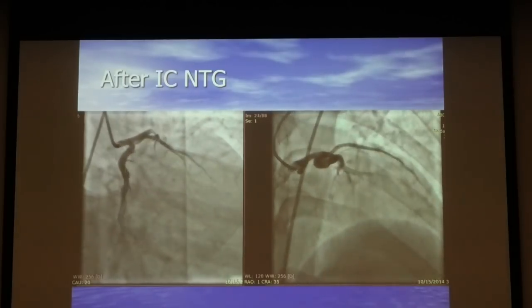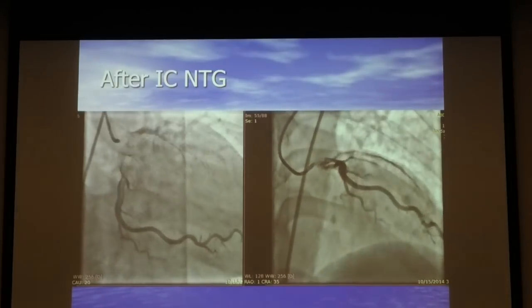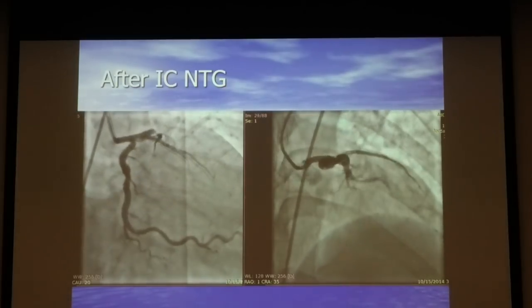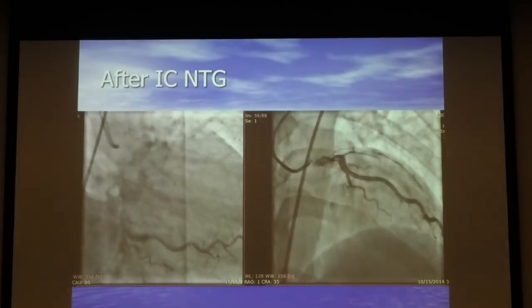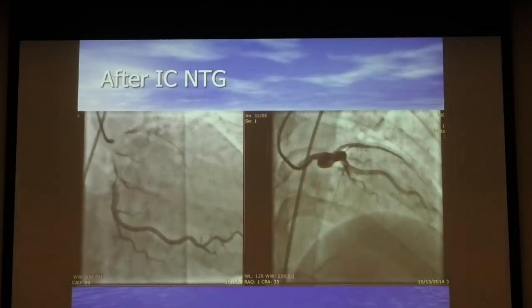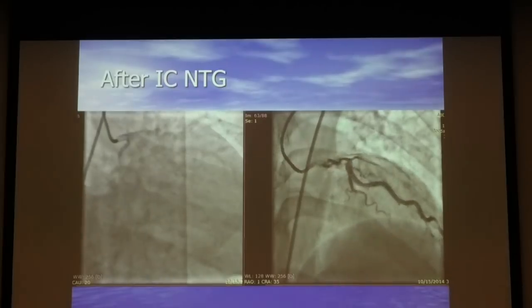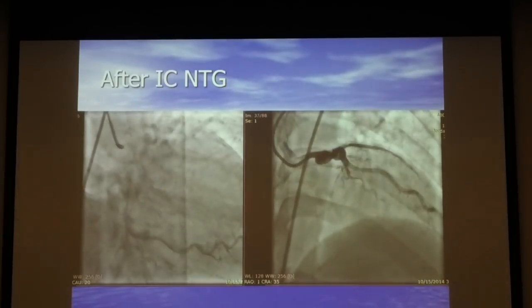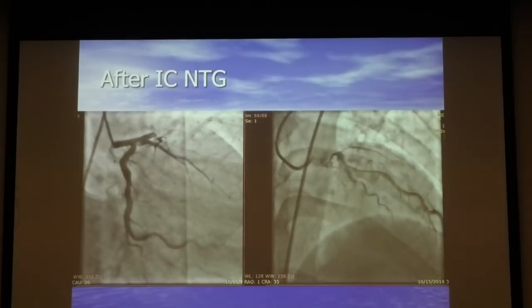So this is what I call proper diagnosis of these patients. هاي تحول من left main ل LAD. It's a routine strategy of left main LAD PCI. But at least we did not have to change our strategy. We did not send him to surgery unnecessarily. And we avoided, if we want to do PCI, doing left main bifurcation PCI.